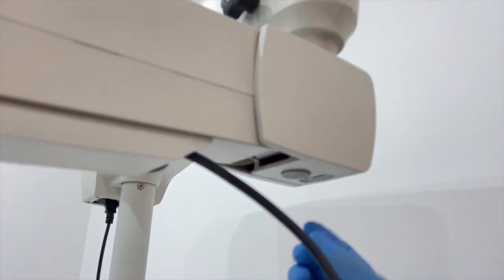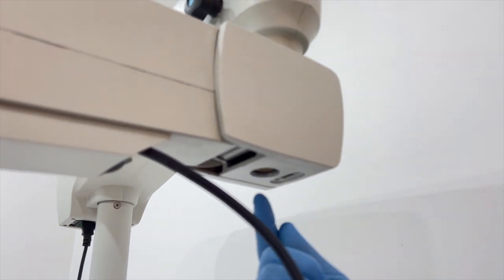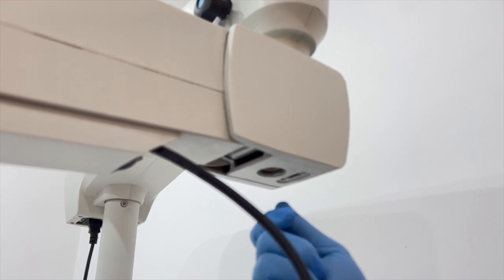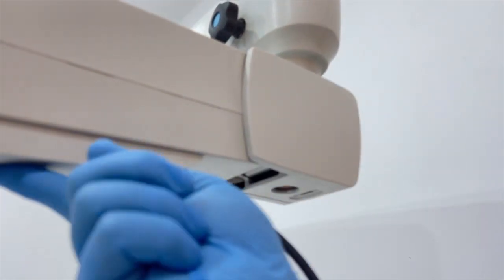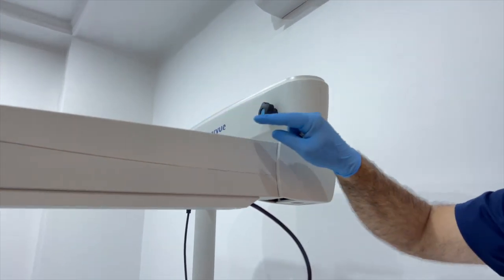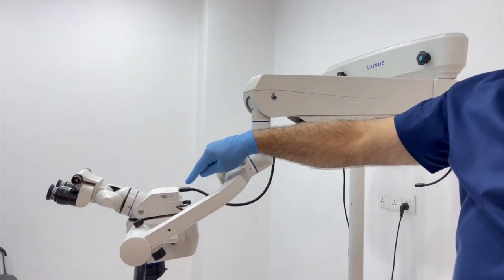We just remove this screw cap, and inside we have a screw, operated by an Allen spanner or screwdriver. We can rotate it clockwise to make it go up vertically, or anti-clockwise to make it go down. So this is about the balancing of the secondary arm and the head of the microscope.